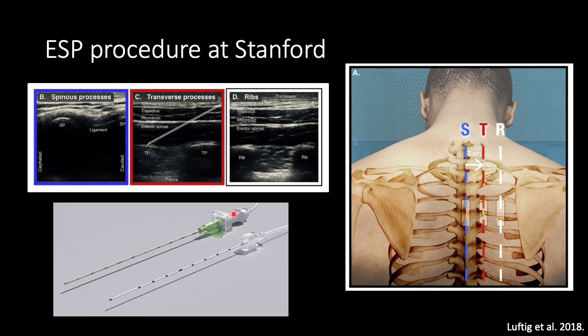And you may see us use these e-caths, which are catheter over needles, which we think may, in some circumstances, more favorably enter the fascial plane as compared to using our standard arrow catheters.